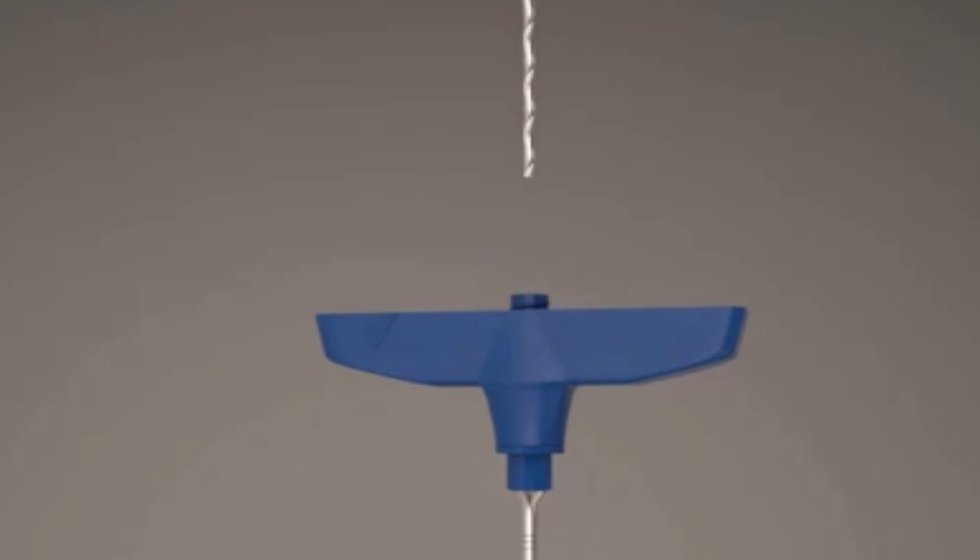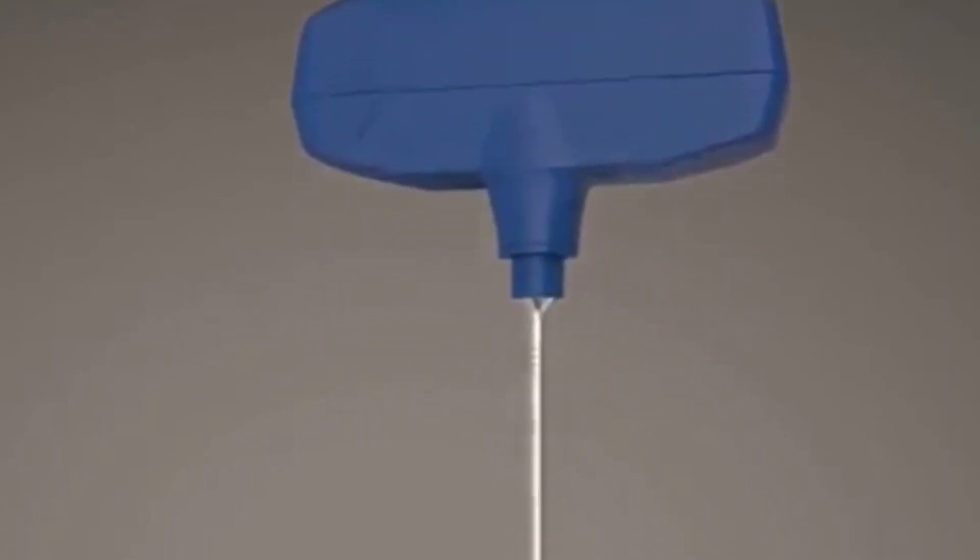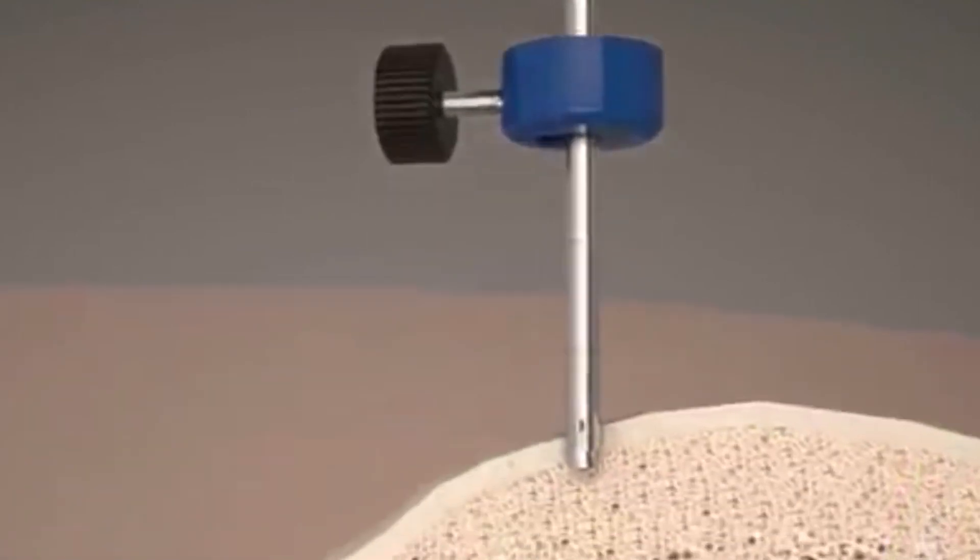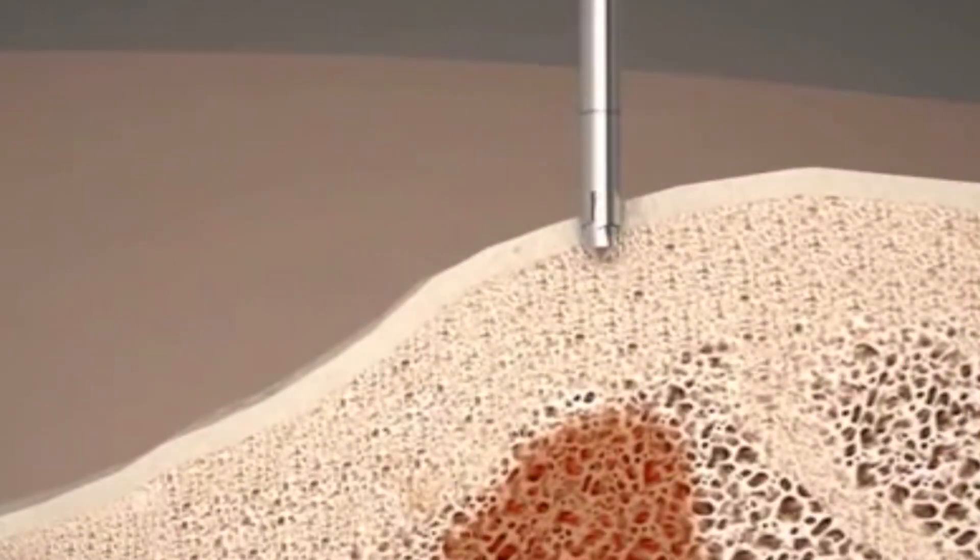The drill is now inserted into the cannula. After aligning the triangular impressions on the handles, the drill is locked into place. With firm, but not excessive, pressure, the assembled drill introducer is advanced clockwise through the cortex.